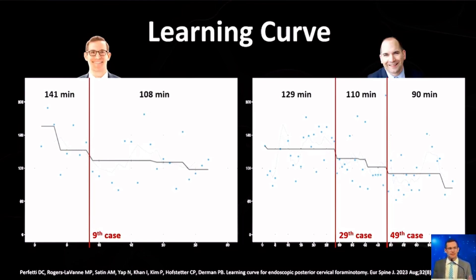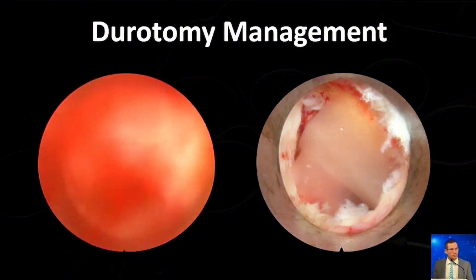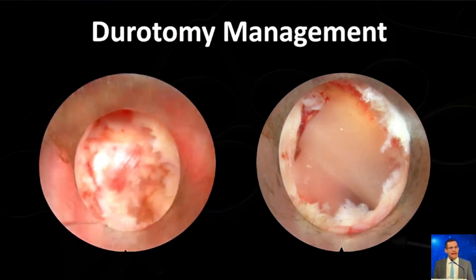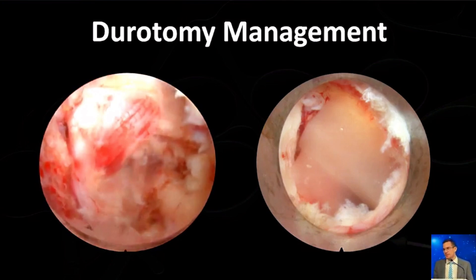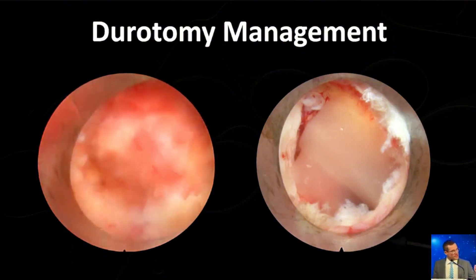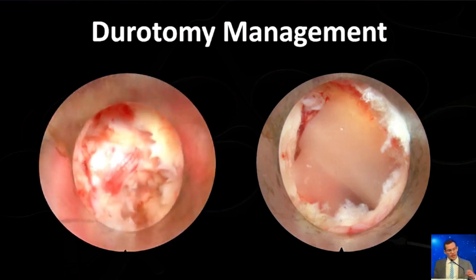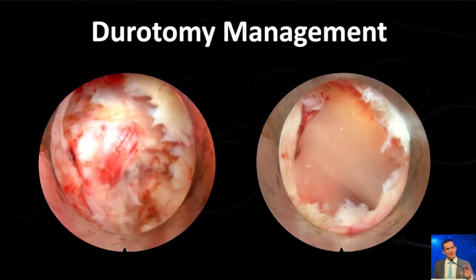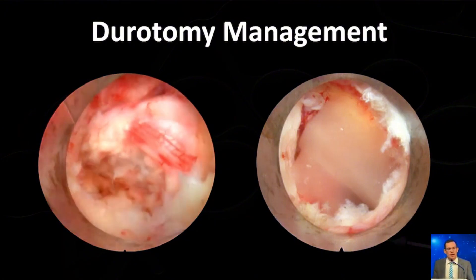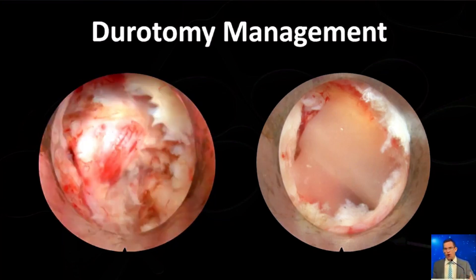What has improved with time is operative efficiency. Regarding durotomy management: most durotomies tend to be very small, even though they look really big on your screen, and because there's a lack of dead space, they don't tend to be symptomatic. Here's a durotomy from a separate case at a very tight spondylotic level, in the nerve root sleeve and shoulder where it connected to the dura — not amenable to direct repair regardless of technique. I just take a piece of collagen matrix, place it over that area to help contain it, close, and treat patients as I would anyone else with no particular restrictions. The vast majority have not been symptomatic at all, and I've not had to return to the OR for any of these patients.